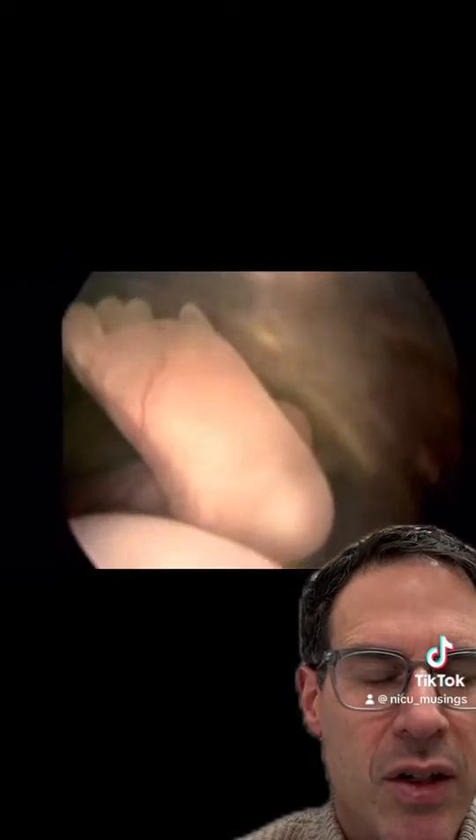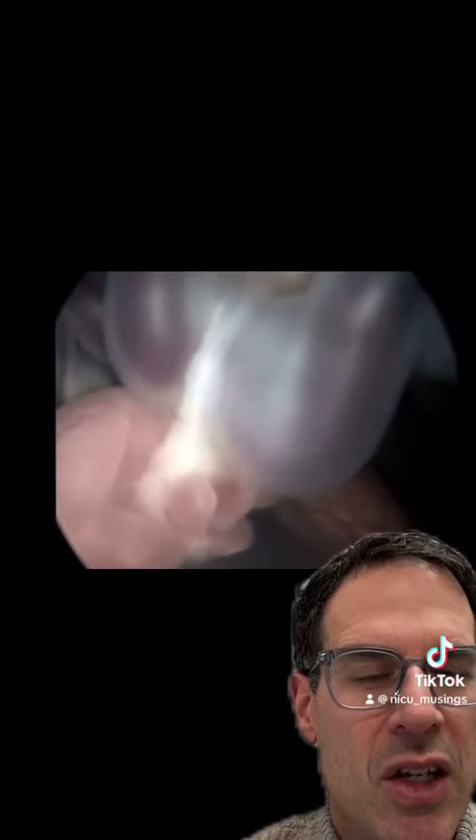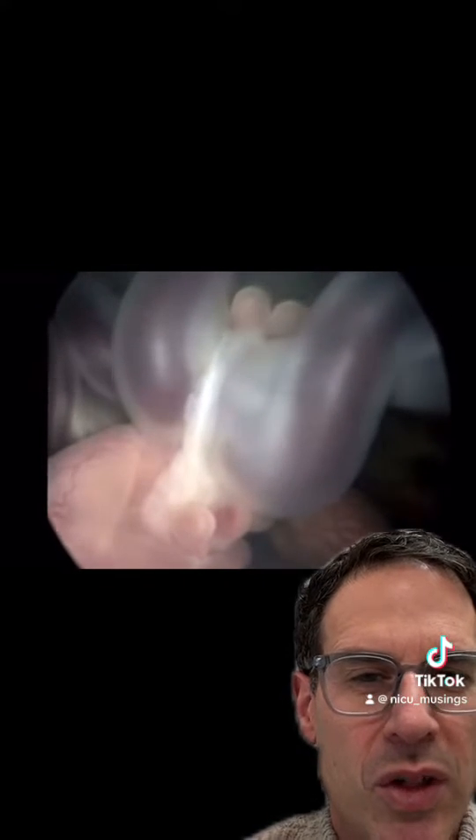Tissue coming off this innermost layer of the sac the fetus is growing in can come across and encircle a limb, as you saw there. In this case it was the fingers. You can see it encircling the umbilical cord as well.